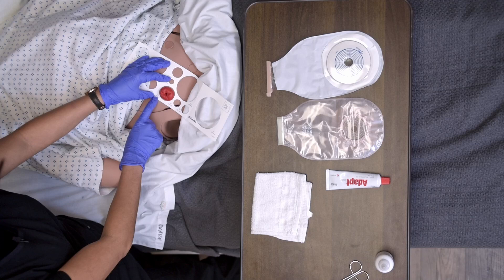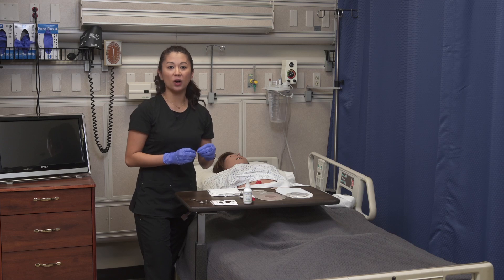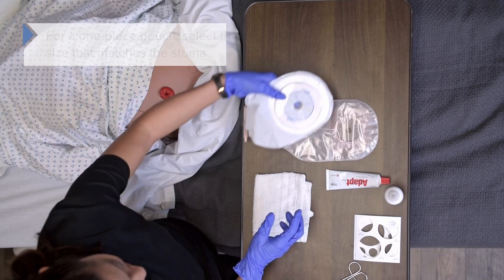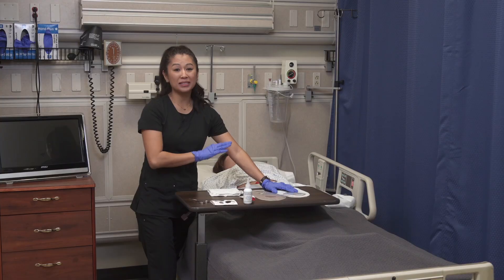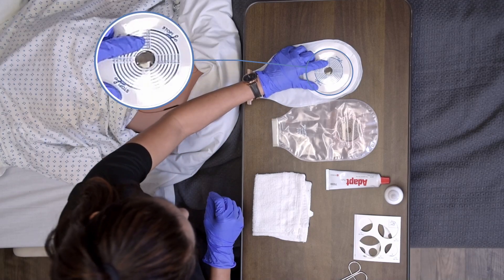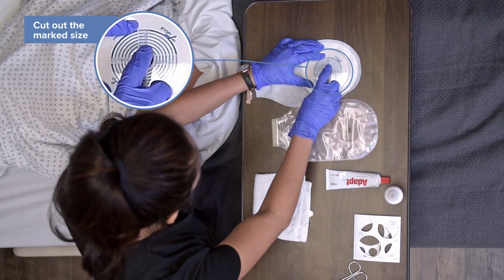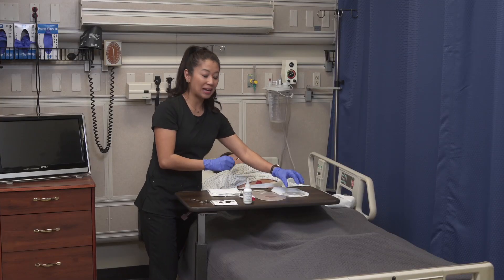Now that we've measured, let's look at how to fit the appliance. For the one-piece, notice there are measurements printed on the bag itself — you can see the 25, 32, and 38 millimeter lines. All I would do is cut around that 38 millimeter line with my scissors all the way around to fit the stoma. That's the one-piece device.